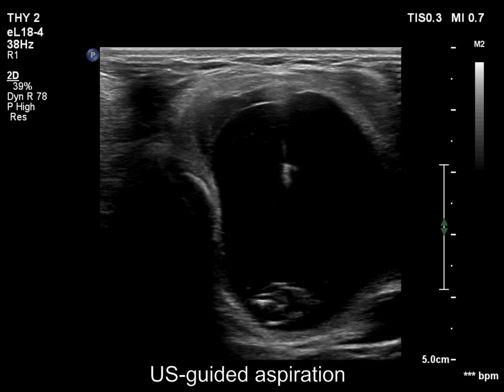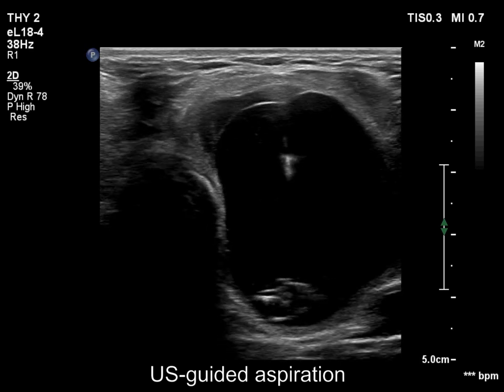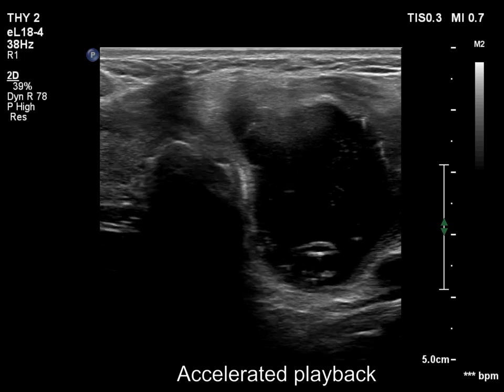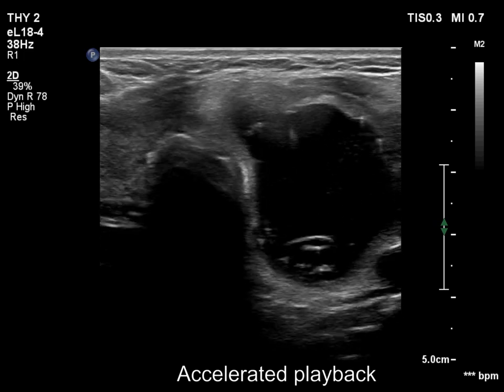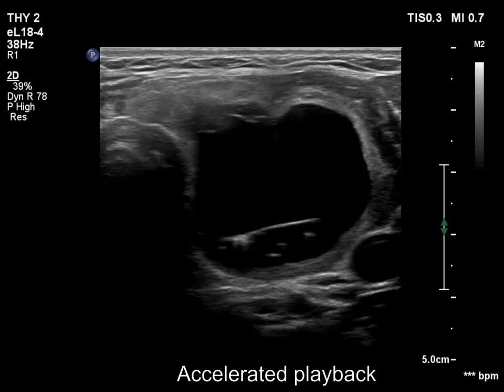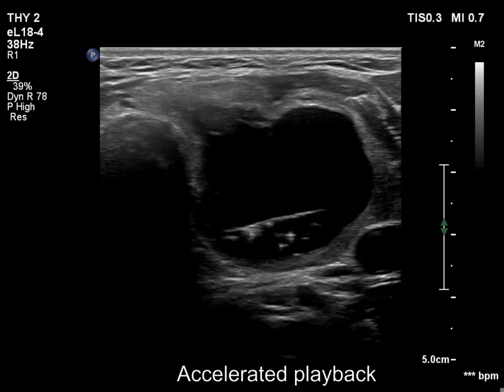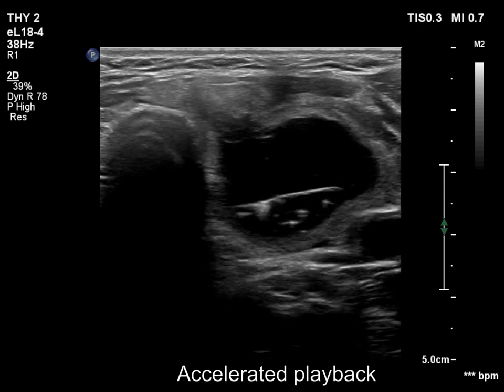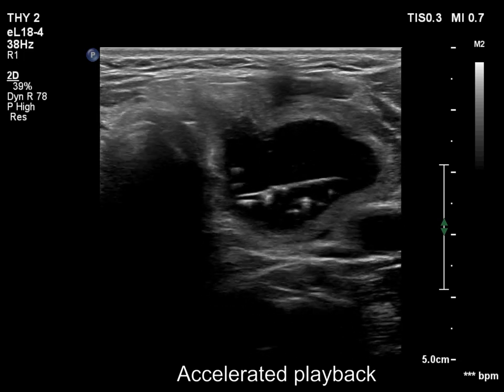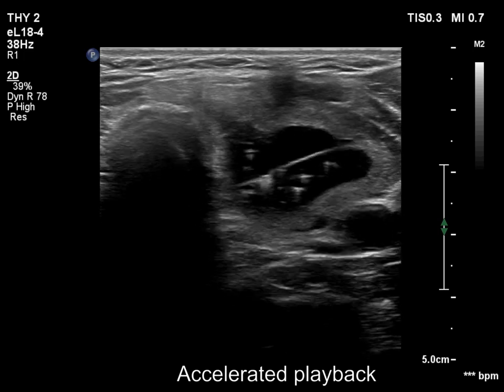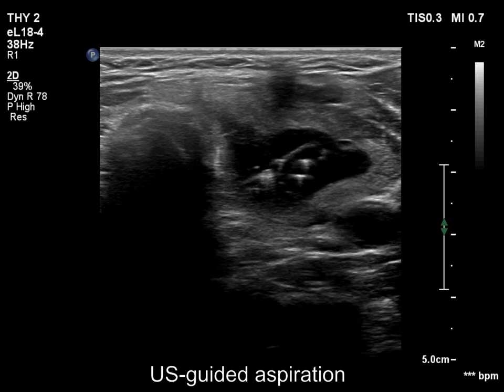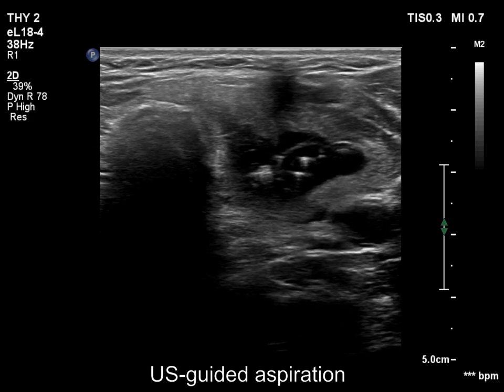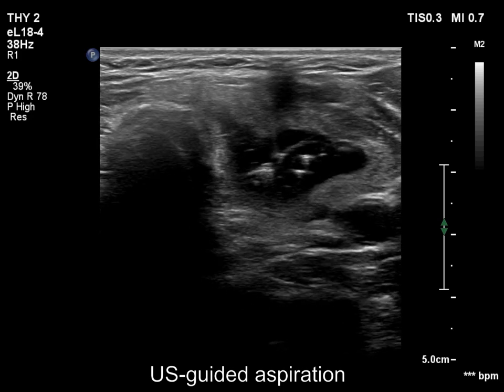Now I show the aspiration of 12 mL of cystic fluid. Note the large comet tail artifacts in the dorsal part of the fluid.